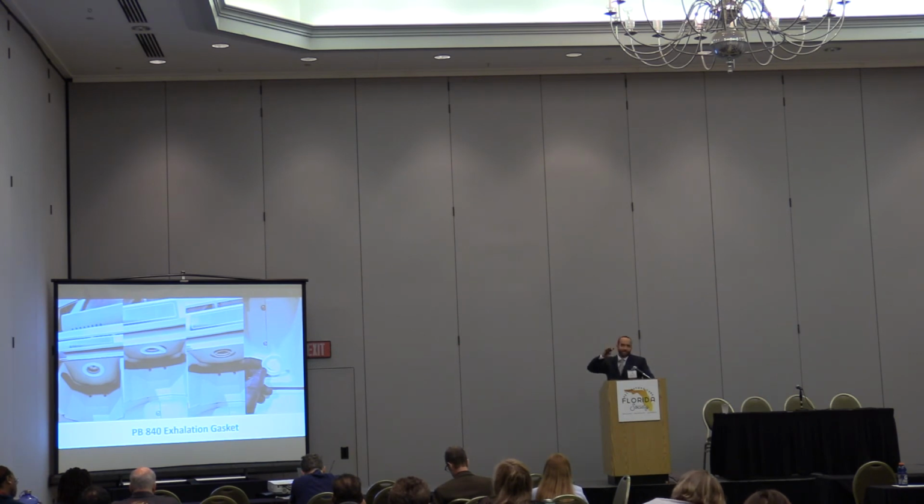And again, this is a very simple $35 piece of rubber, but I've had ventilators that have been end-of-lifed, or just retired from the hospital, because they were sent to biomed, couldn't fix it, and it turns out all it was missing was this gasket, and no one caught it. And I mean, to scrap a ventilator for a $35 piece, it just doesn't make too much sense.